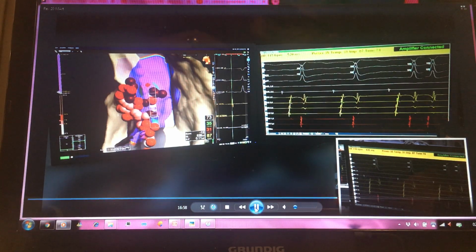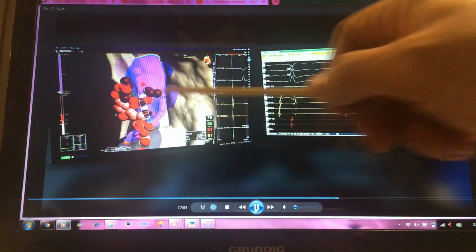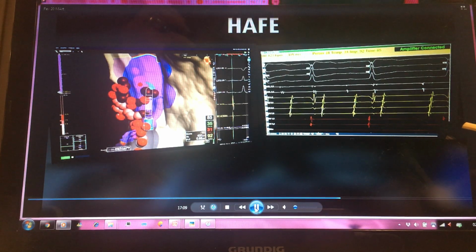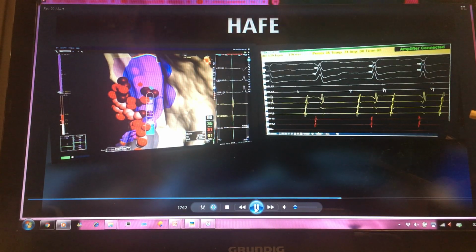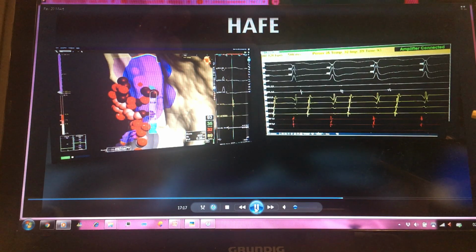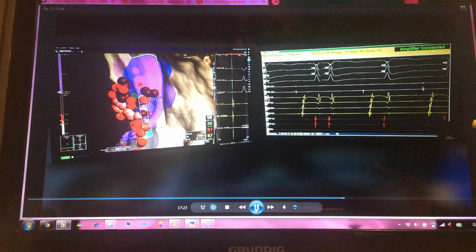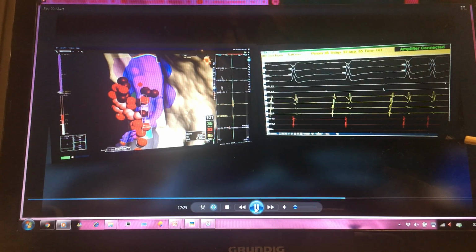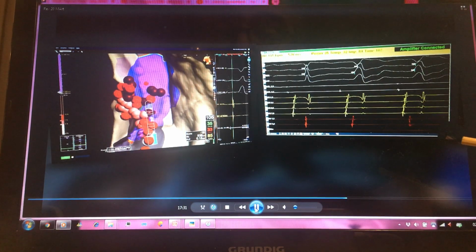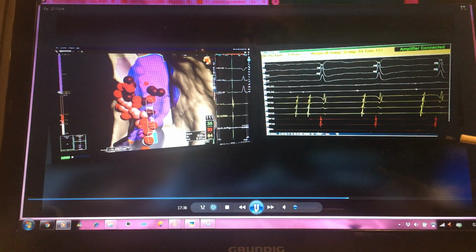In right atrial side, we usually don't perform ablation in interatrial septum area because to achieve good catheter tissue contact is not easy in right atrial side, and also your catheter may move to this area or atrioventricular node area in right atrial chamber. So to perform ablation in left atrial side of interatrial septum seems more reasonable or more reliable in those cases.